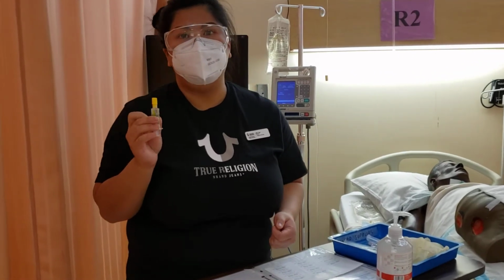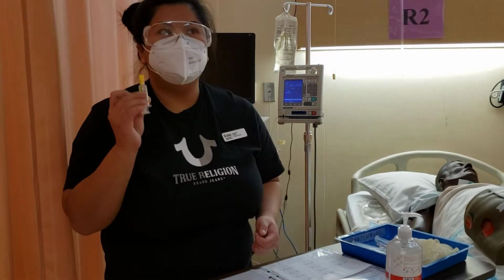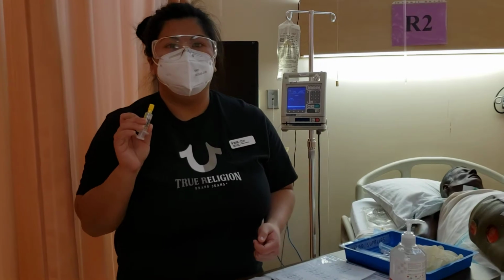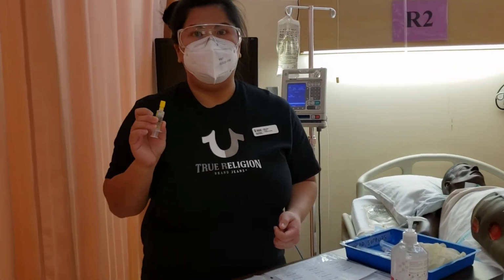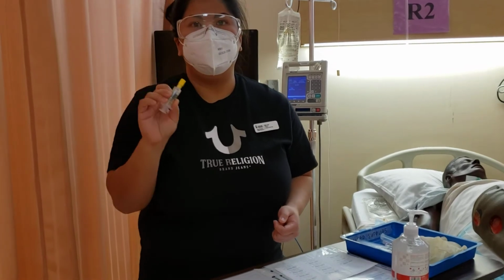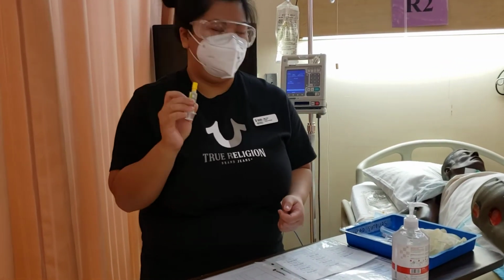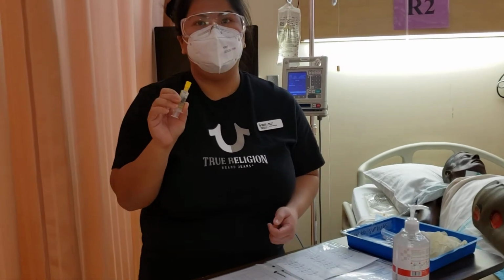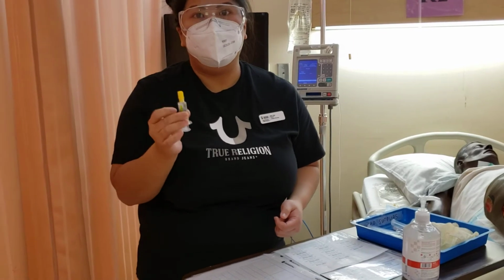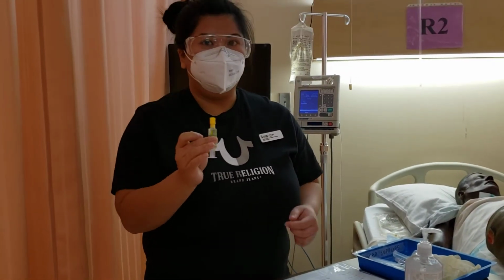For a subclavian line, we are going to be locking it with 200 units of heparin, and the concentration for this one is 100 units per mL, and I have 2 mLs in the syringe. I already got rid of the excess. Also, in the clinical setting, this would come in a package and the tip would be sterile, but since we reuse this for practice in the lab setting, they're no longer in the package.